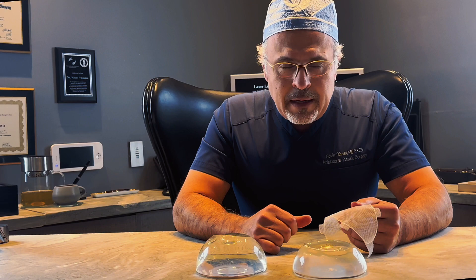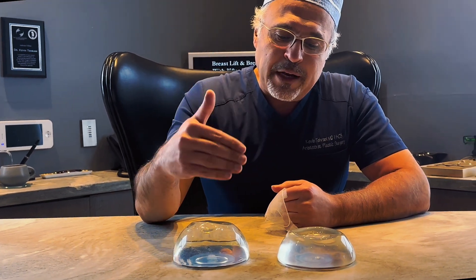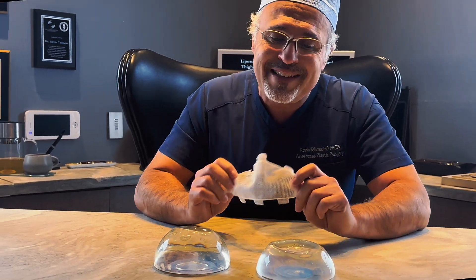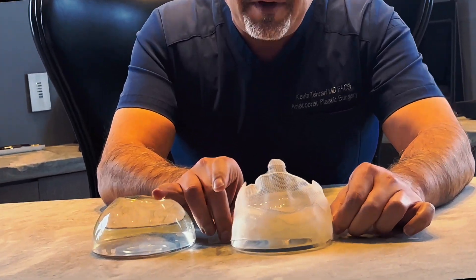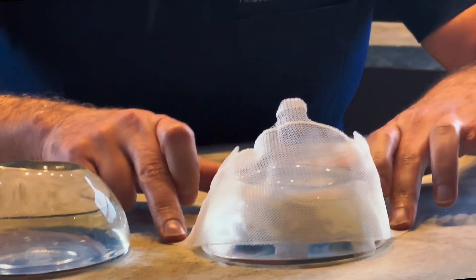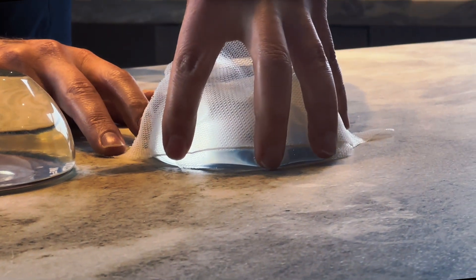I want to talk about how we do implant support, especially when we talk about an implant exchange or implant upsize — particularly larger implant sizes — or patients that have a lot of laxity after weight loss or pregnancy. They need support in their breasts, and we need to do an internal bra. My favorite way of doing that is with Galifax 3D mesh, to provide support around the implant and use the suture tabs to hold it into the muscle.